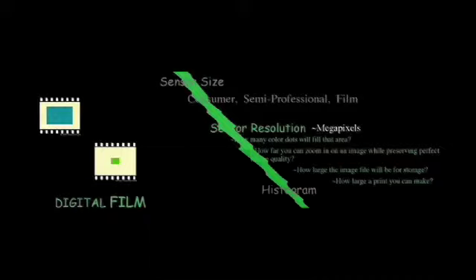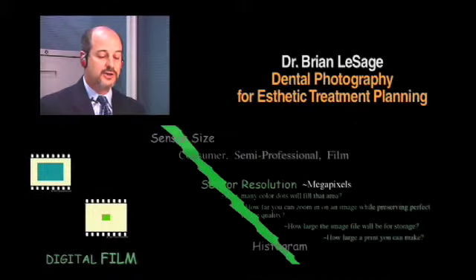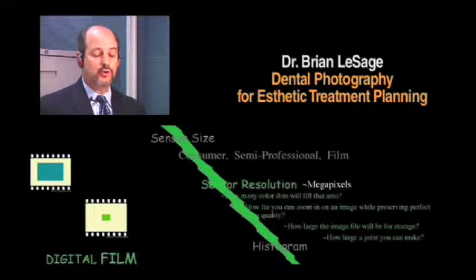How far can you zoom in on an image while preserving perfect image quality? Or how far can you blow this image up to get a nice, perfect quality image? That's really what we're talking about here. How large the image file will be for storage, we talked about that. Most of these images in their full resolution were being stored at about 20 megabytes. So we'll distinguish the difference.